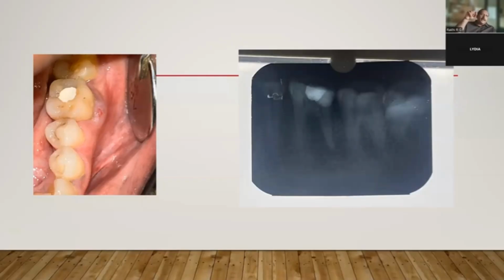You need to insert a GP cone and push it to any area where you feel resistance. Naturally, that sinus has to be an epithelialized sinus, so that will definitely permit the movement of the GP cone. And the GP cone is naturally radiopaque. So it is going to go to the area where it is permitted to the maximum. That will be the area from where the source is.